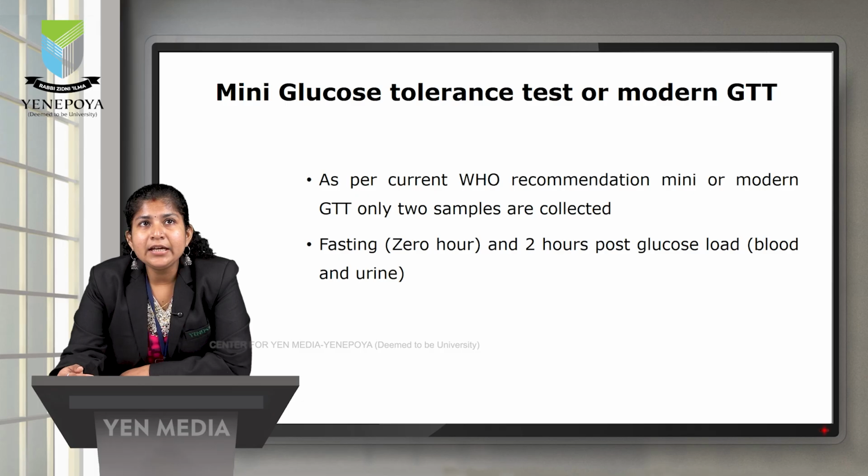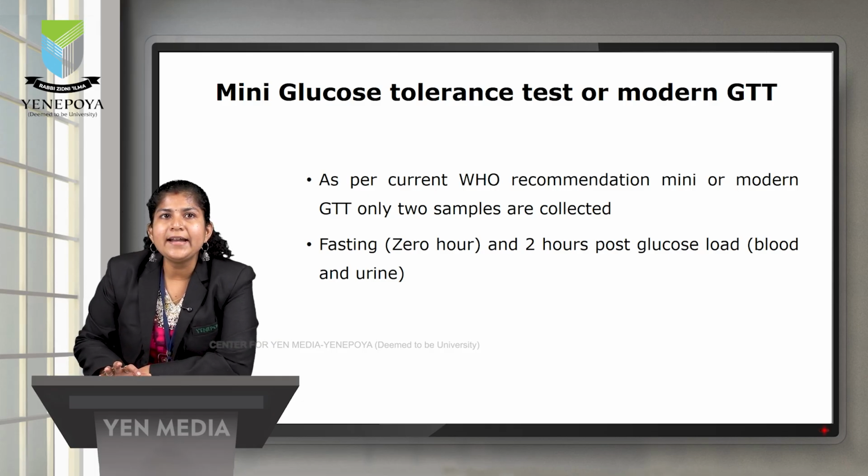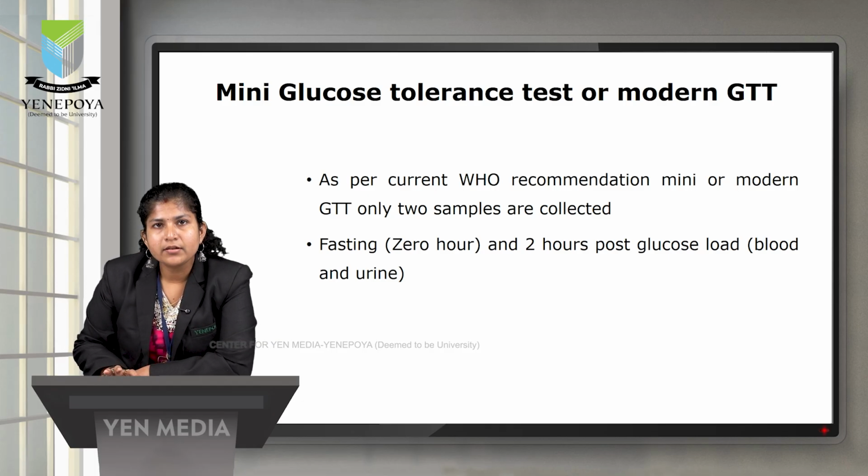Next type, mini glucose tolerance test or the modern GTT. As per the WHO recommendation, here we are collecting 2 samples. One is fasting and one is after 2 hours of glucose load. Here both blood and urine samples are collected.